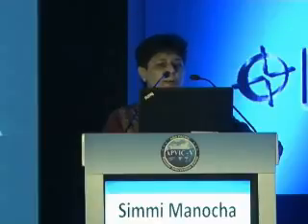Then there are buttons for freezing the image. It can freeze or unfreeze the image depending upon the area we want to see.